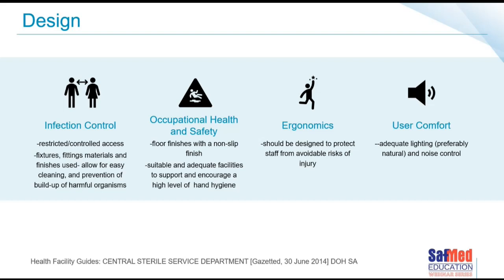What about the ergonomics? If we just think about our heavy sets and our heavy packs, that of course we overload in the South African setting like you cannot believe, but we have to lift them, we have to carry them, we have to transport them, we have to put them on the shelves in our CSSD. What about the ergonomics involved in that? And user comfort. User comfort, of course, matters about the height of the table that you're going to work on, the lighting that you need, the amount of noise that you're going to be exposed to in all of our areas. So when designing the CSSD, don't forget we need to take into account infection control, occupational health and safety, ergonomics, and user comfort, all important factors.